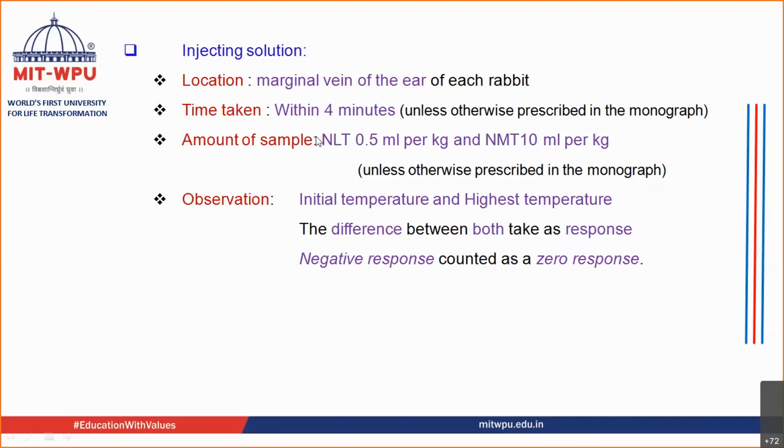You are going to inject it. Time taken for injecting is near about within 4 minutes. Otherwise, whatever has been prescribed in the monograph, that you have to follow.